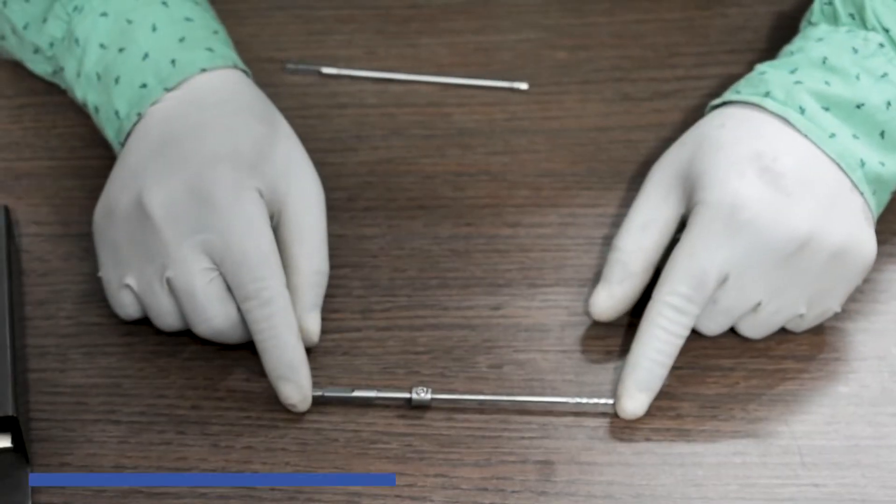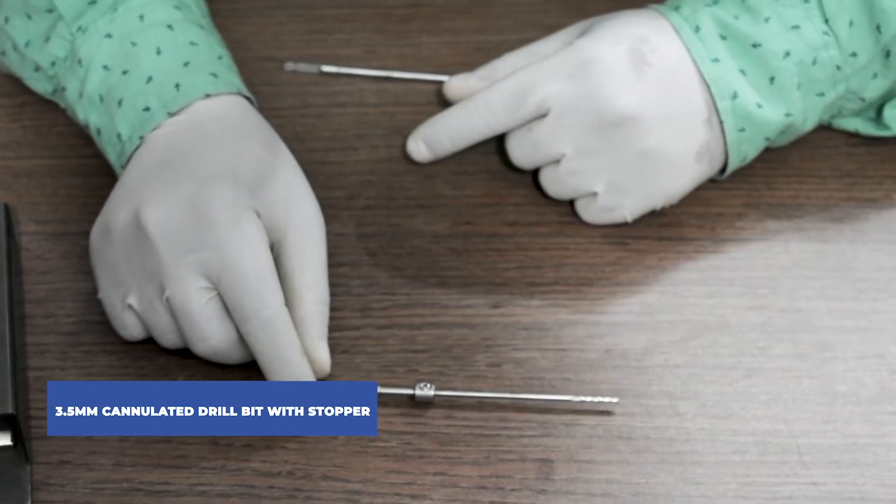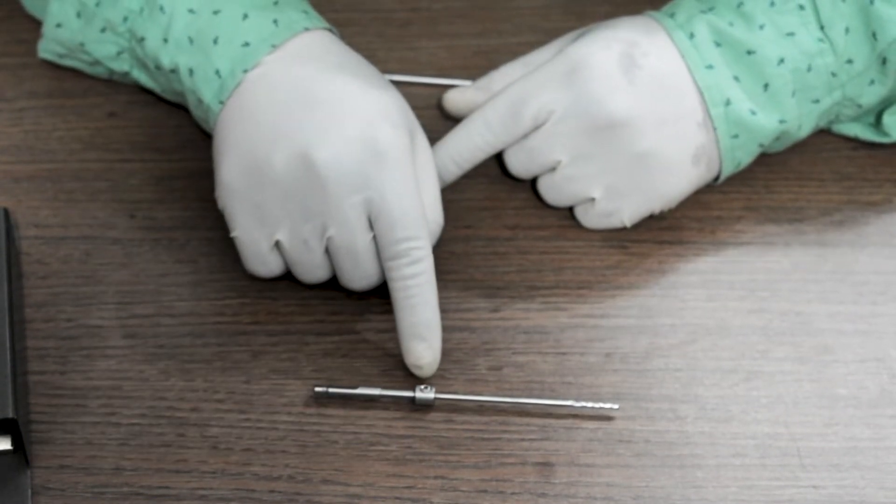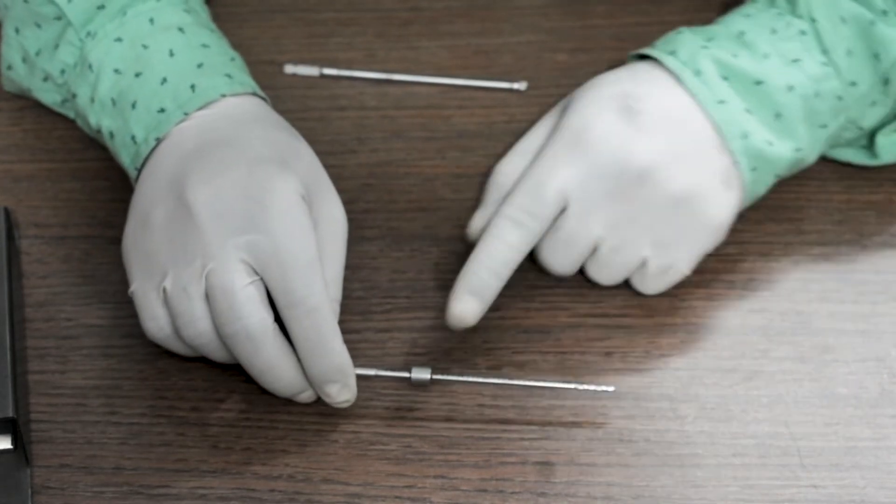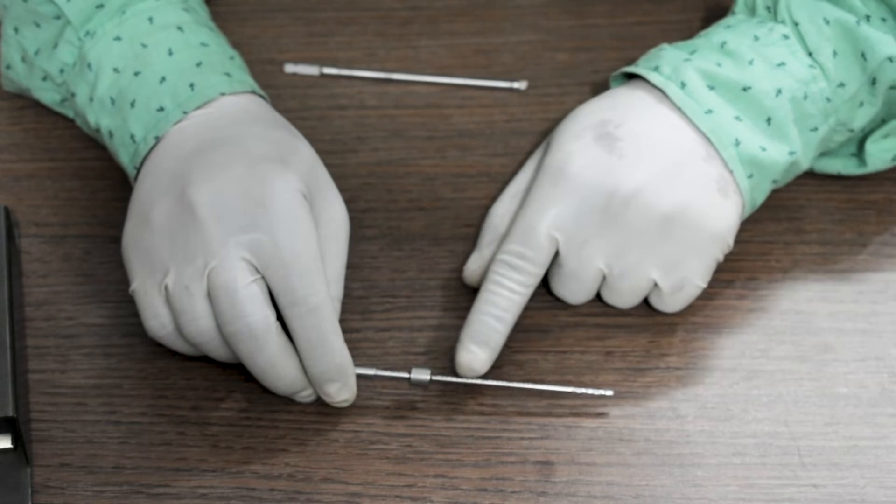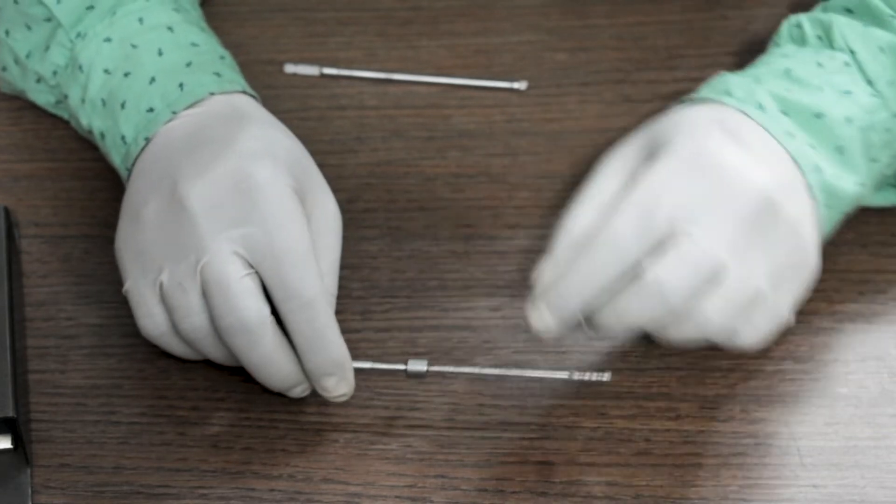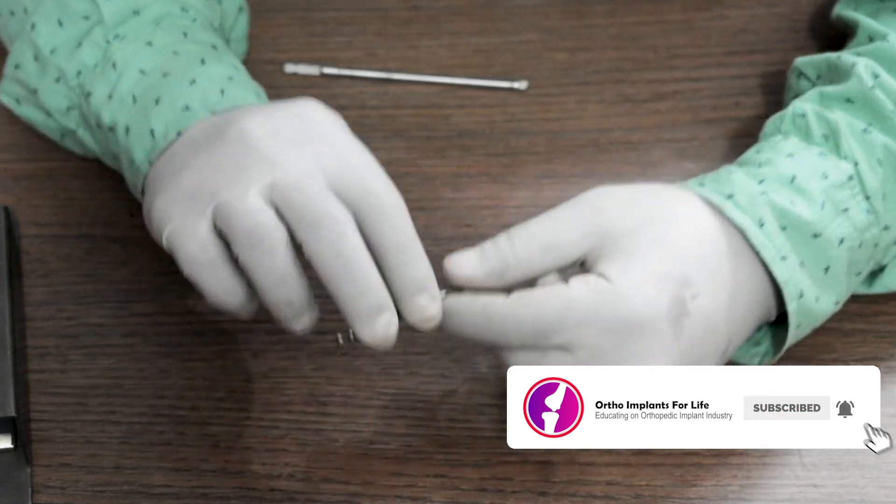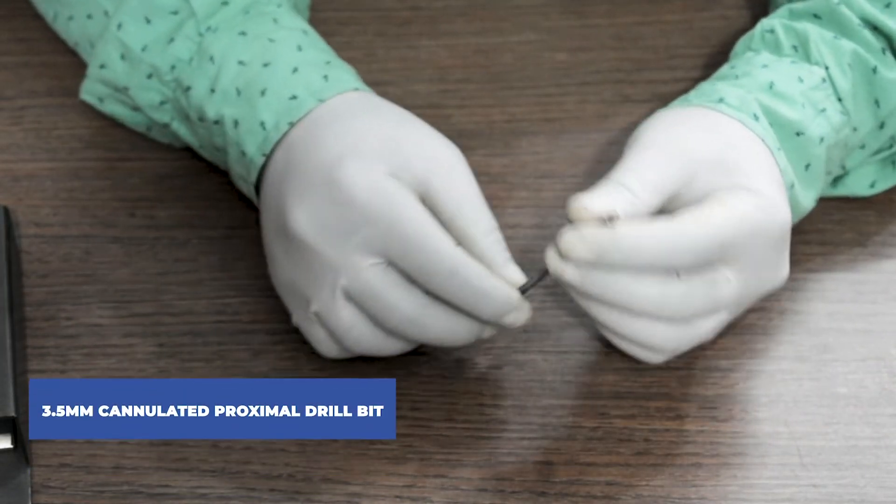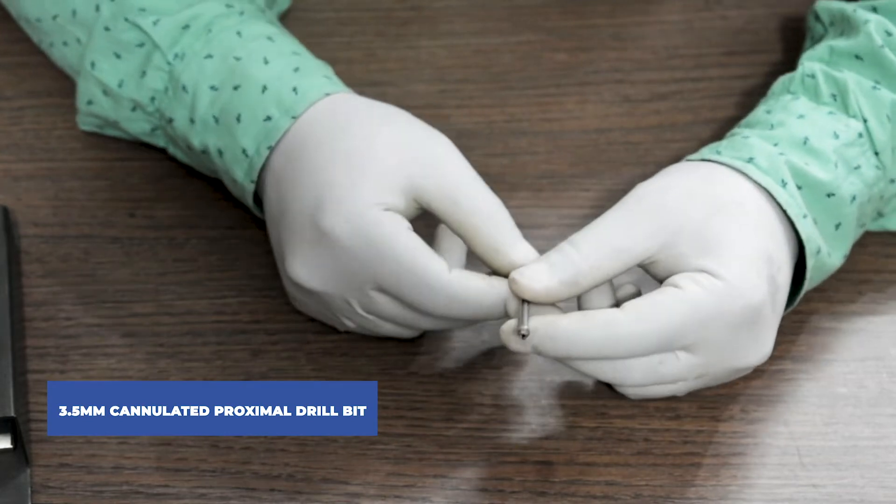This is a 3.5mm cannulated drill bit with stopper. This one is called the stopper. It also has a measurement scale marked on the side. As you can see, this is cannulated. This one is 3.5mm cannulated proximal drill bit.